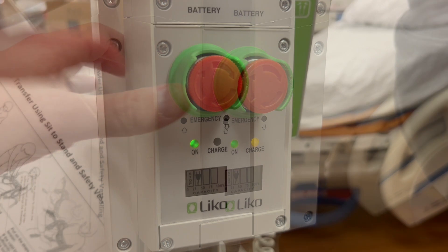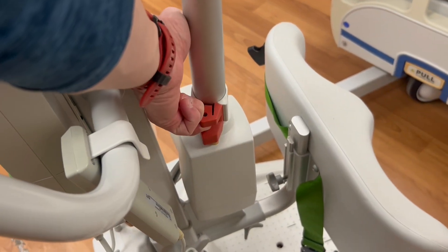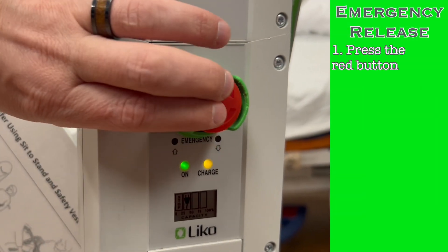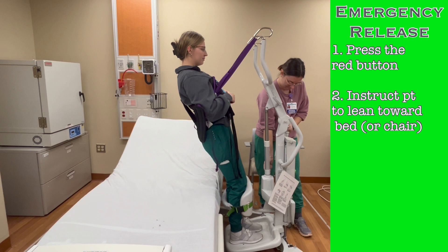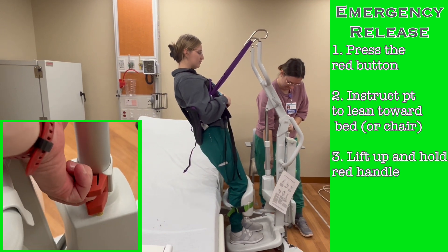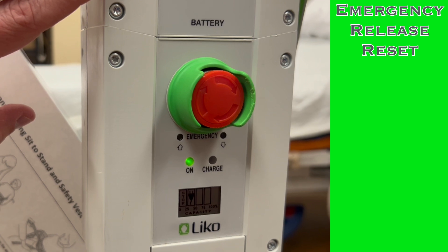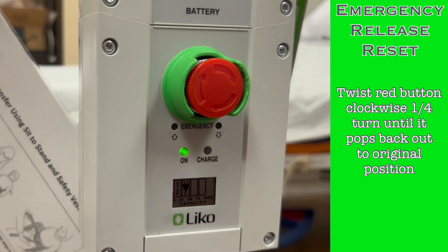When the battery is charged to 100%, the charging light will turn off. Above the lights and screen is a large red button, and around the side of the lift you'll notice a liftable handle. These red controls work together as an emergency release. If the lift controls suddenly stop working — which can happen if the battery dies while transferring a patient — press the red button on the back until it clicks and stays pressed. Then have the patient lean back toward the bed or chair so their weight is pulling down on the lift, then pull up on the red handle. The hydraulics will slowly and safely lower the patient to a seated position.